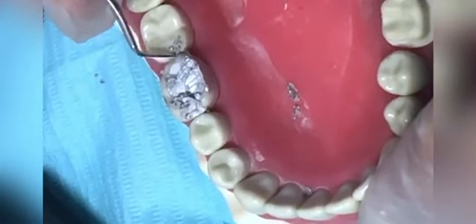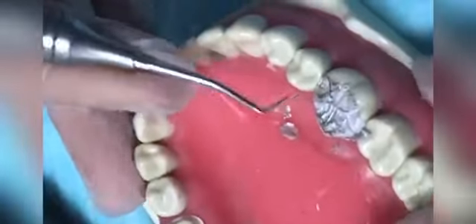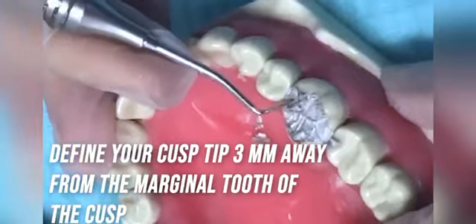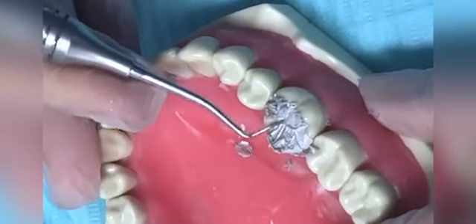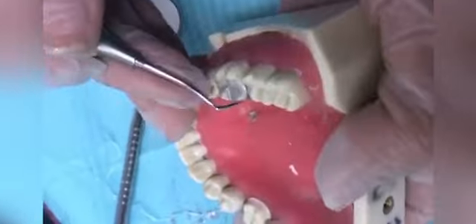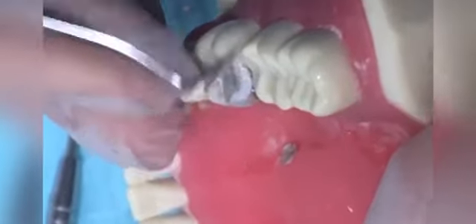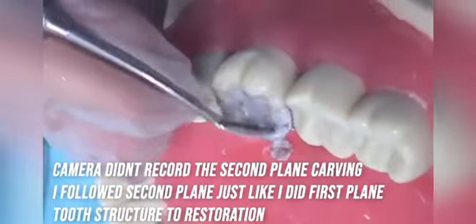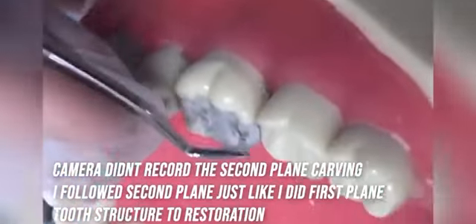Here I'm doing the basic anatomy, keeping my instrument at an angle of 30 degrees, half on the tooth surface and half on the restoration. So it will not create any ditch. Okay, so I'm lowering the marginal ridge height a little bit, because if it's high the restoration can break and it can come under the straight fail criteria.